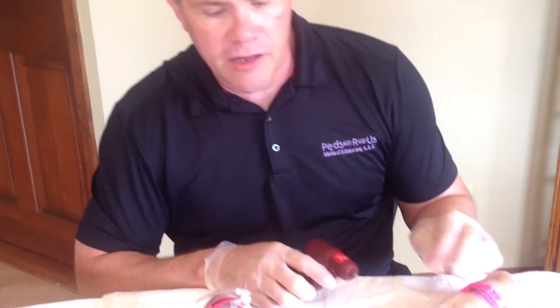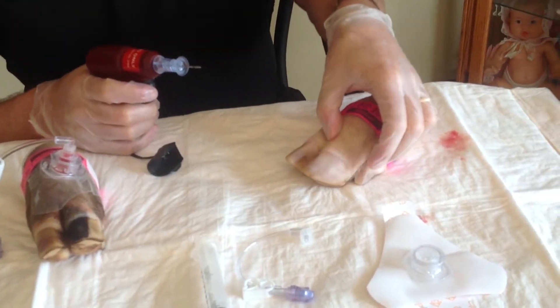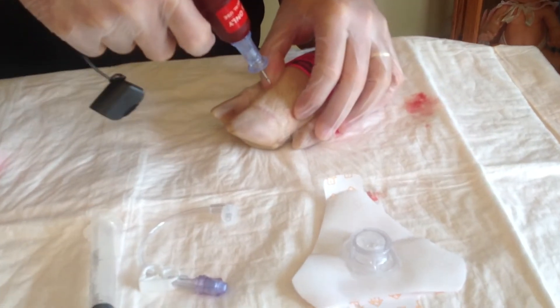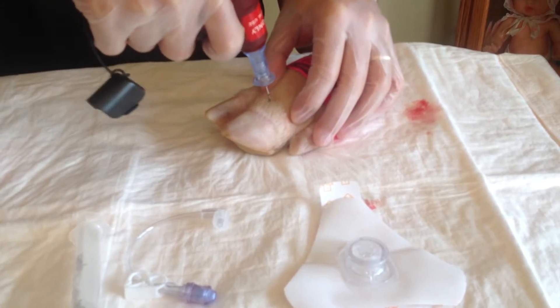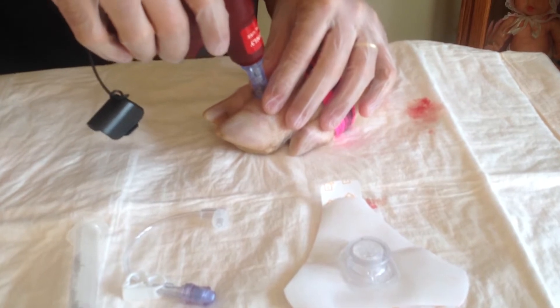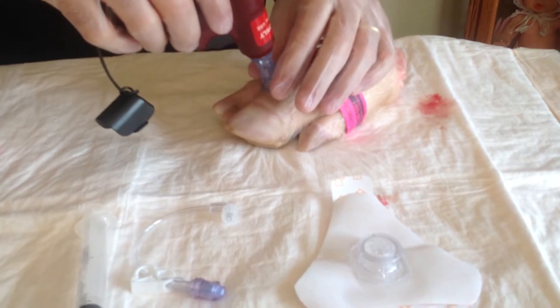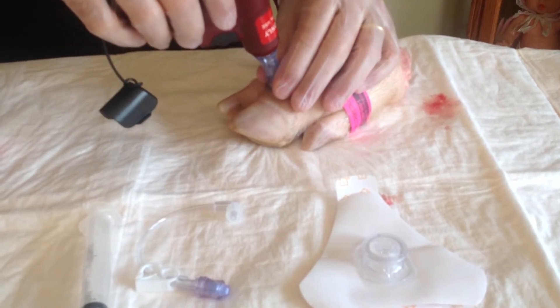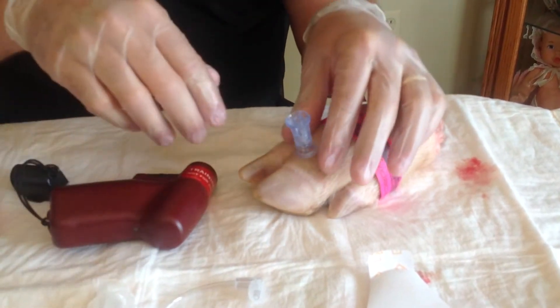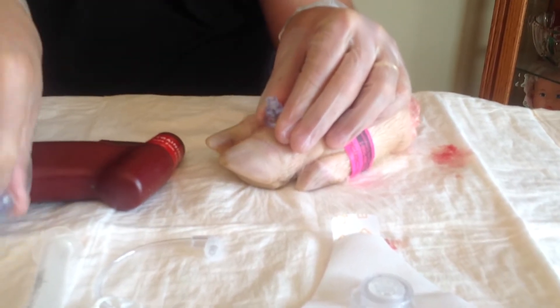So in our case, when we go ahead and place a traditional EZIO, we find the bone, we put one finger on one side and our thumb on the other so we can stabilize the bone. Just as with a child or an adult, once we've found the right spot, we simply drill straight up and down until you can feel the lack of resistance. Once it's in, hold on to the model — everything you don't want to lose. The only thing we want to remove is the drill, so we hold the needle. We want to keep the needle in the bone but remove the top part, so we hold the bottom and unscrew the top.